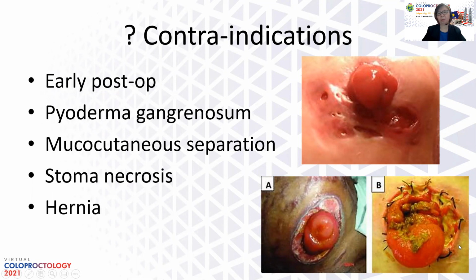You also want to consider twice before using convexity. If you can, you need to use some dressing to seal up, and then you use some skin barrier at the side, and then you use the one-piece or two-piece appliance on top. Still, you can manage sometimes.